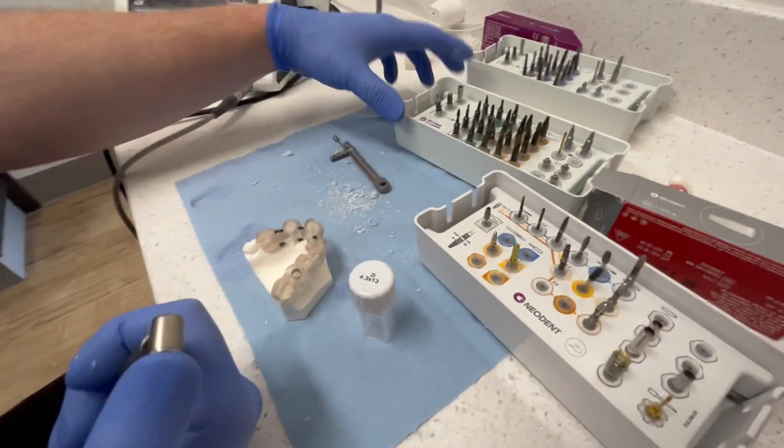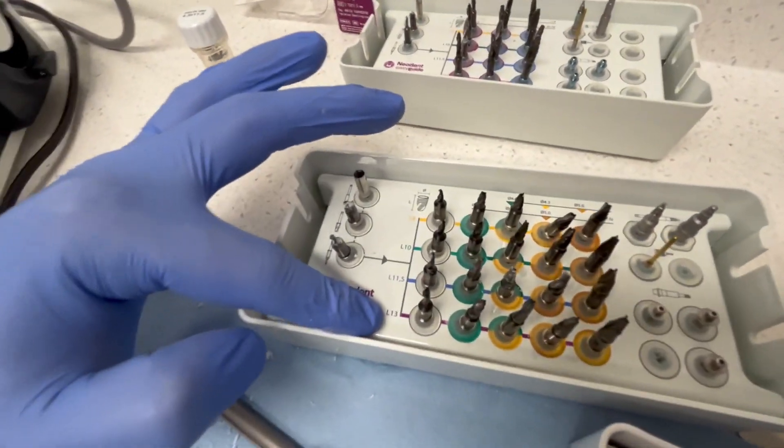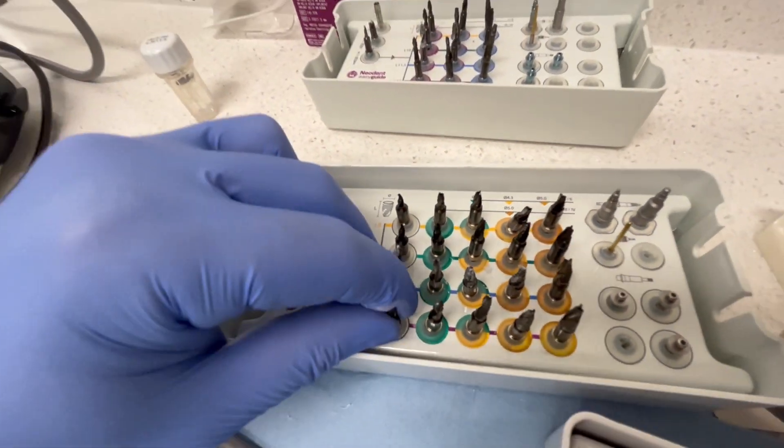In this case, we're doing a 4-3-13. So we're going to go down to the 13-millimeter row. And we're just going to follow this workflow.